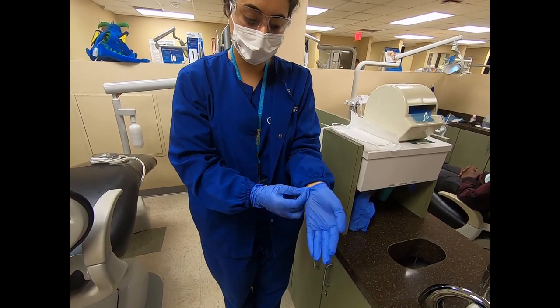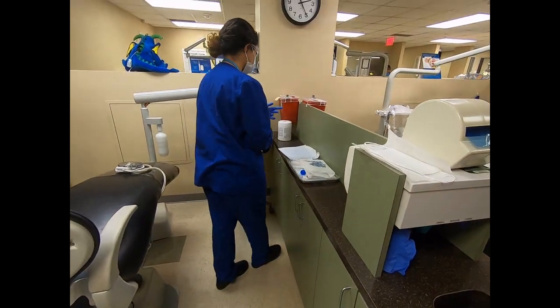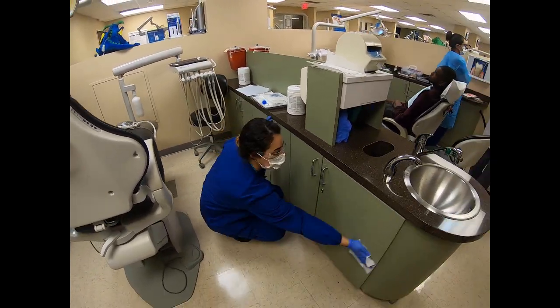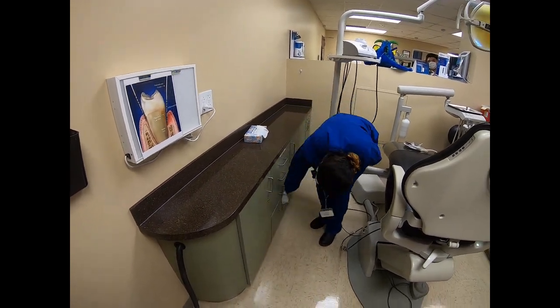systematic manner with a Cavi wipe. Use new wipes as needed because the wipe should be saturated enough so that the surface being disinfected may remain wet for 2 minutes. All surfaces of the room should be disinfected.